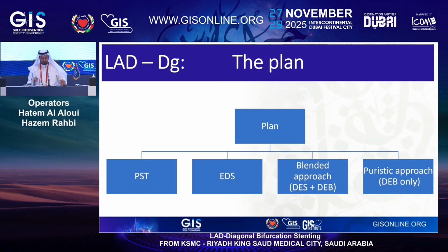Great, I think, Dr. Hatem, can I stop you there? Let's have a few minutes to discuss it with the panelists here about how they would approach. You gave us a few options there, and let us take the opinion of the panelists. How would they treat such a lesion, a 011 LAD diagonal? Start with Dr. Habib. Yeah, thank you very much.